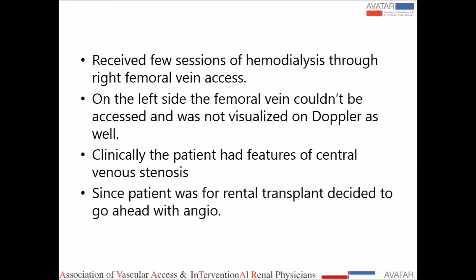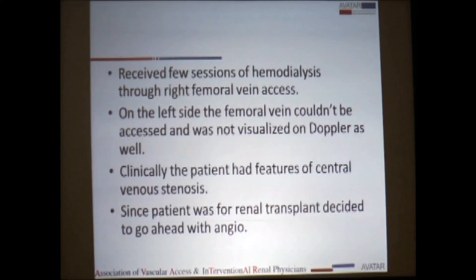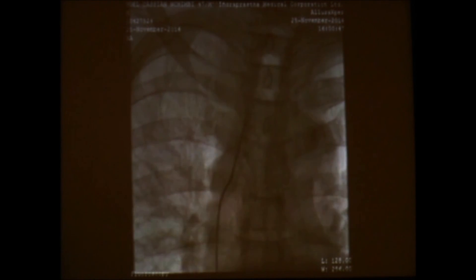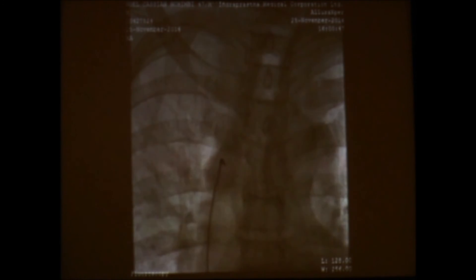Since the patient was being worked up for renal transplant, we decided to go ahead with angiography straight away. This is the angiogram of the right femoral vein, which was patent, but we wanted to leave this vein alone since it would be required in the future for transplantation. Through the right femoral vein we pushed the catheter up to the heart and proceeded with angio shots.